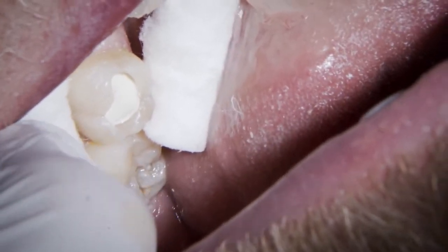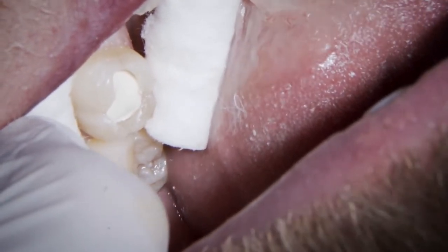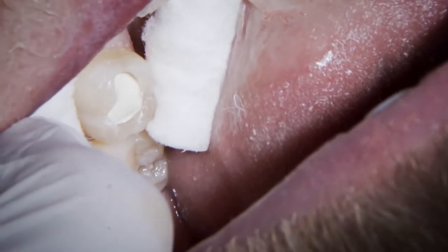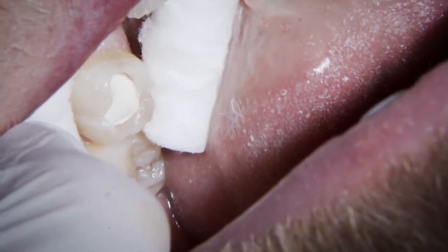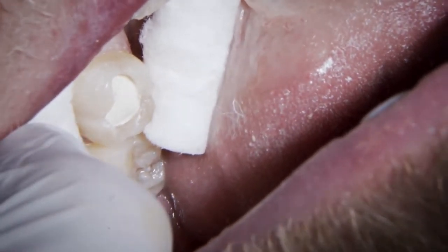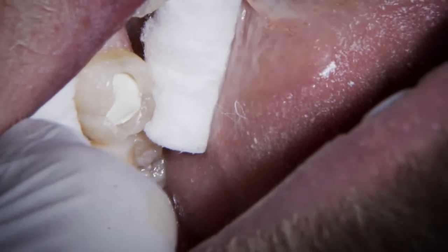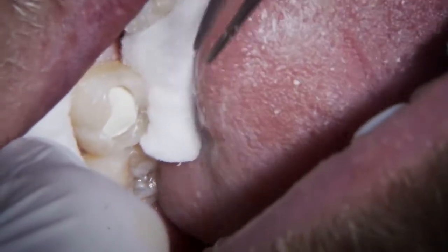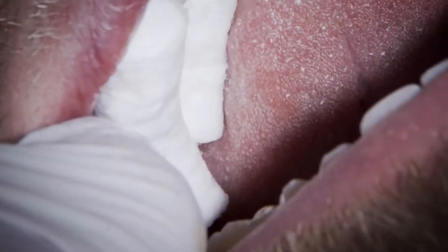So we'd set the timer — it's been set since the biodentine was mixed, for 15 minutes. Under ordinary circumstances we would have planned to do other little jobs in the mouth, incorporating that timing into the treatment plan so it's not dead time at all. If there's nothing else, I'd use the time for writing notes. We'll pop the patient out in a moment once I've got that initial setting and the surface layer has started to form — no worry about moisture contamination at that point.